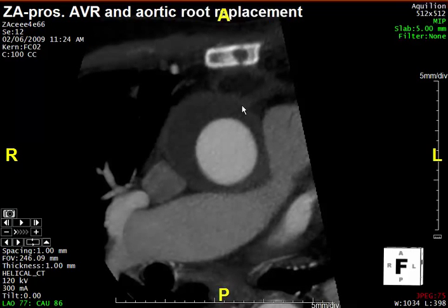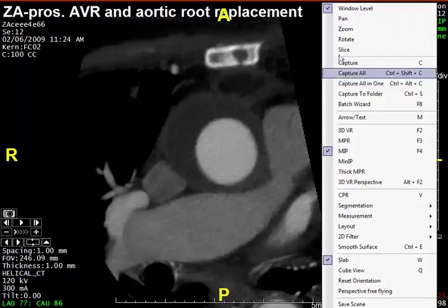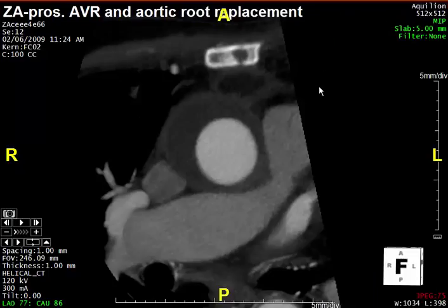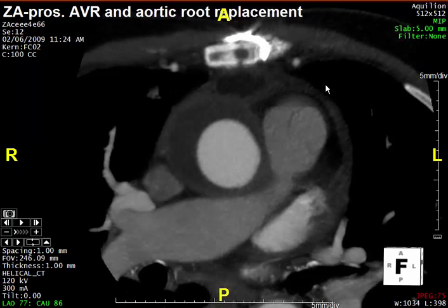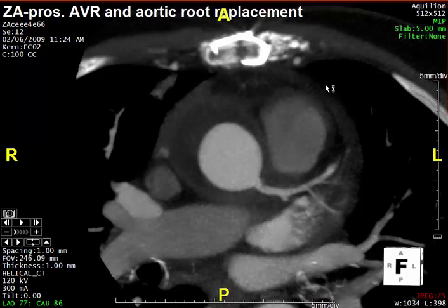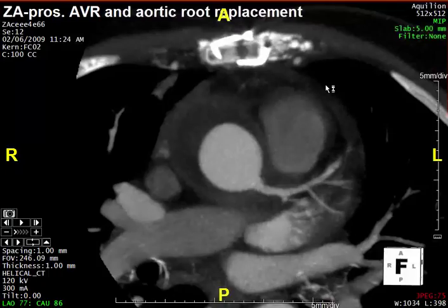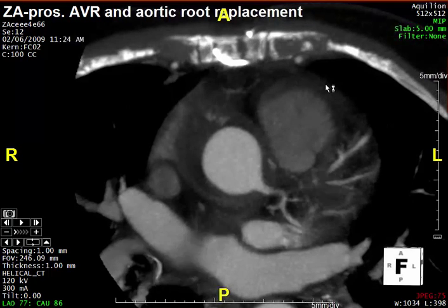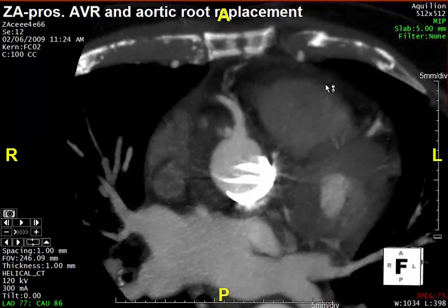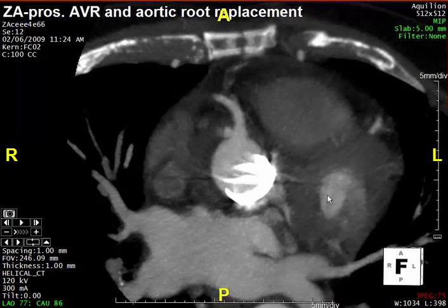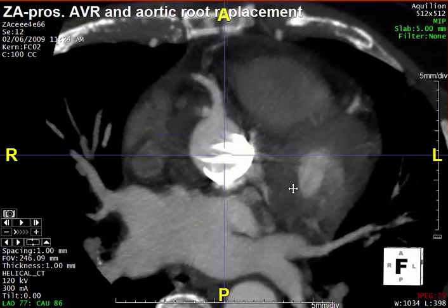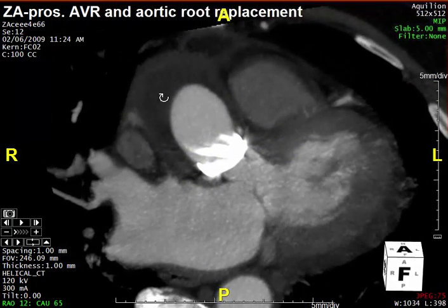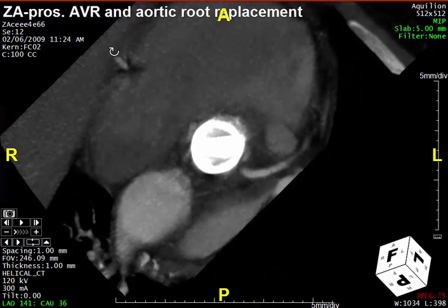This is a 30-year-old individual with Marfan's syndrome who had a spontaneous type A aortic dissection. He had replacement done with an aortic conduit and an aortic valve. You can see the collar around the aortic conduit in the area of prior thrombus formation. Coronary buttons were actually replaced within the conduit — you can see the one going to the left main and this one showing the right coronary artery.